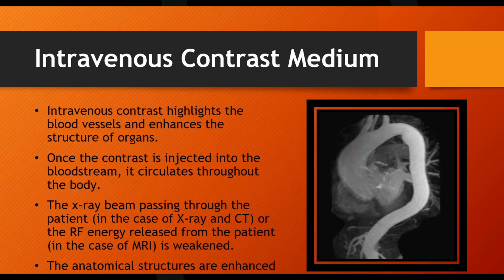No, basically what happens is, the reason for the magnetic field is they place the patient in the magnetic field, and your hydrogen atoms, since your body's 70% water, water's H2O, so you have an abundance of hydrogen atoms. It polarizes your hydrogen atoms. Remember your high school science, hydrogen has 1 electron in its orbital shell spinning around the nucleus. When you put a patient in that magnetic field, that nucleus is going to get polarized. Wherever that electron is, when it gets caught by the magnetic field, it's going to get caught by the North Pole or the South Pole.